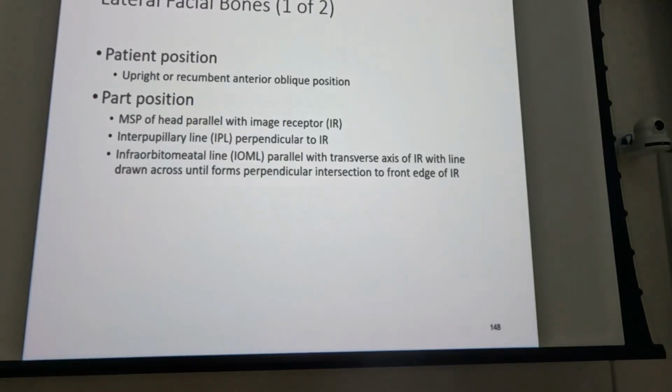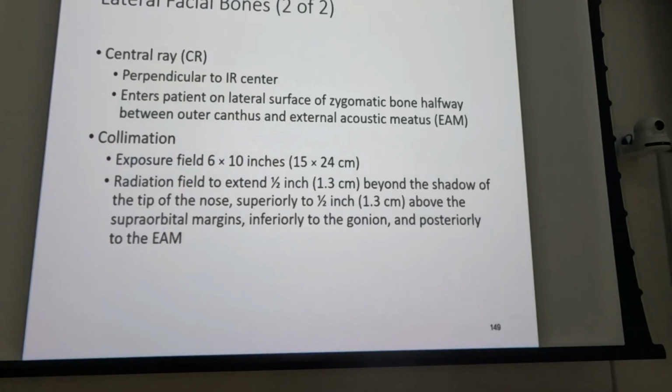You can do it with the patient laying down, you can do it with the patient standing up. Keep in mind that the patient, you know, they took a pretty good lick to the face, so use your best judgment as far as standing the patient up. Really kind of recommend sitting the patient down on something. They're going to be more stable sitting down as opposed to standing up. Less likelihood of them moving around if they're sitting down. So all the same stuff.